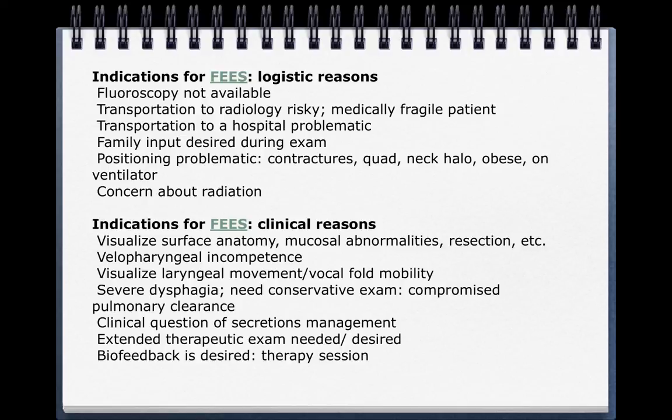And if that is your question, then again, it makes a lot of sense. Patients for whom you have concerns about the airway, those patients too would be good candidates for FEES. If you need any kind of extended look at the vocal folds.